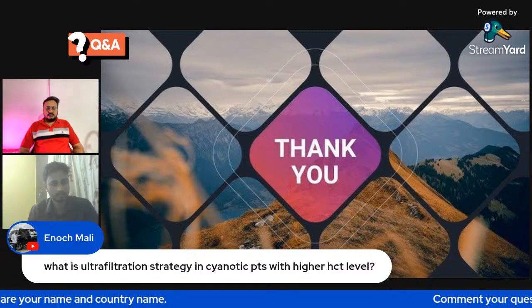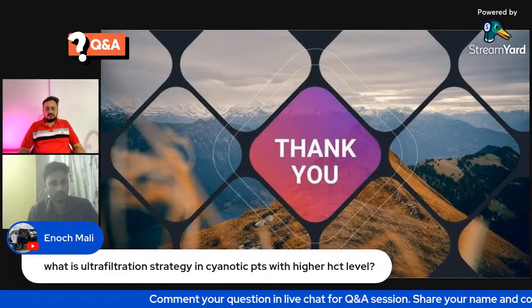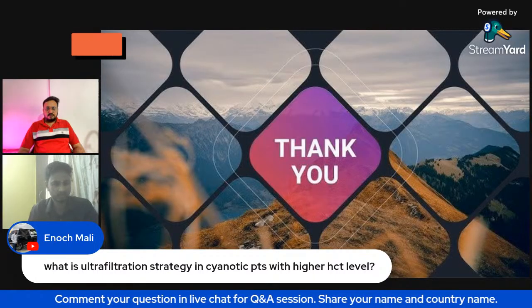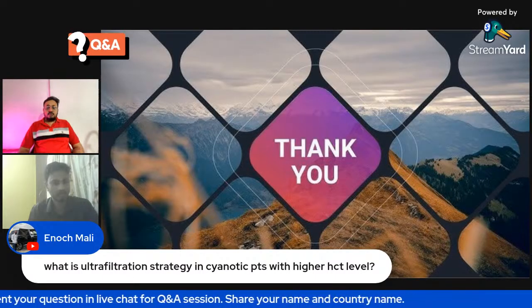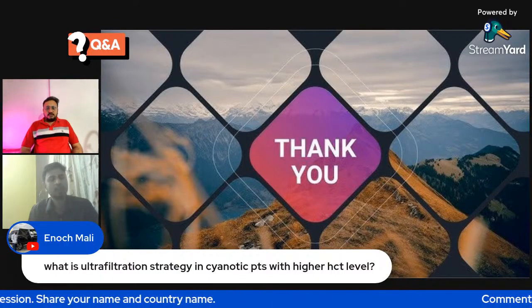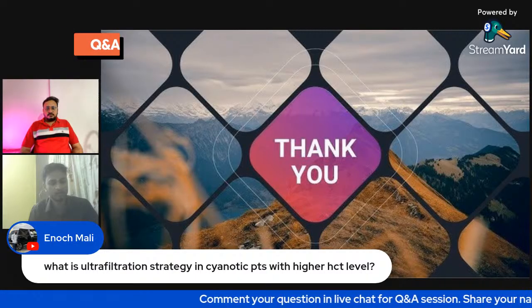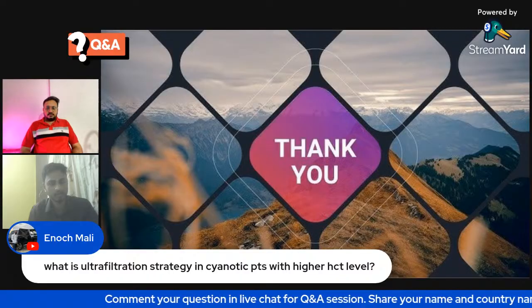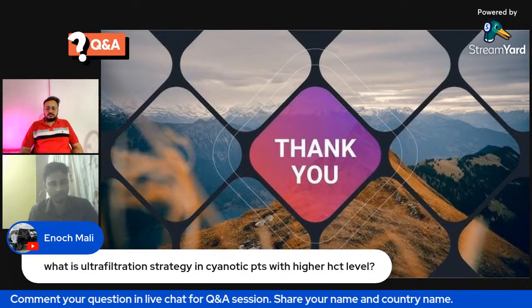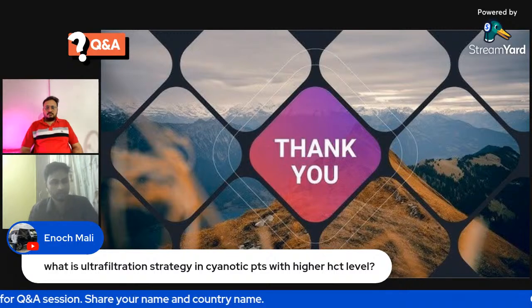Is ZBUF necessary for all the patients? Yes, sir, it is good, especially if there is any inflammation. We decide according to the electrolyte levels we observe. If potassium is too high, we'll use ZBUF. Using it during the rewarming time is beneficial because inflammatory mediators go up at that time.